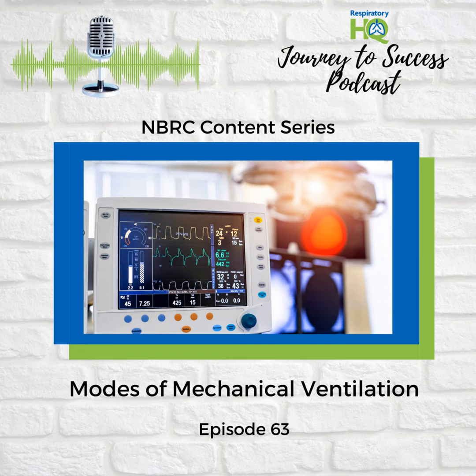Now, you mentioned earlier a mode called CPAP. I know people use CPAP machines at home for sleep apnea. Does that have a role in this whole ventilator picture as well? It does. CPAP, which stands for continuous positive airway pressure, is considered a spontaneous breathing mode. It provides a constant level of pressure to the airways, but it doesn't deliver any preset breaths. The patient does all the work of breathing. So it's less about controlling the breath and more about keeping the airways open and stable. You've got it. It's like a gentle splint for the airways.